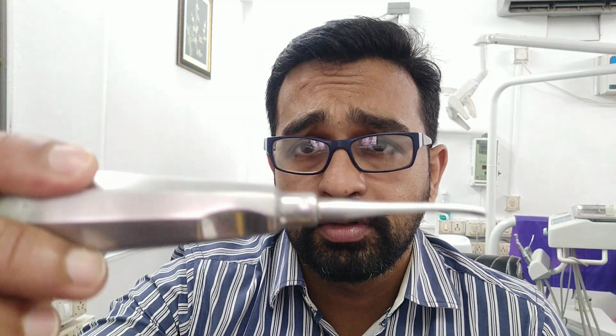So how to remove these kind of teeth using this magic instrument? Today we are going to talk about an elevator, Coupland's elevator, and how to use it in different types of cases. I have made a few diagrams. I hope this video will really help you in your dental clinics and in hospitals to remove different kinds of teeth.